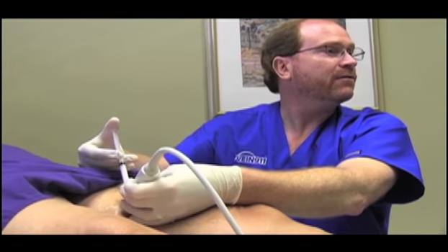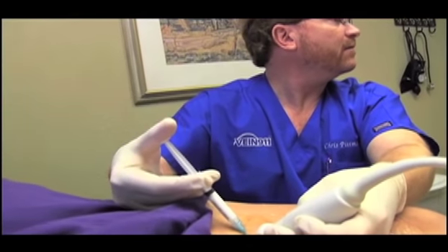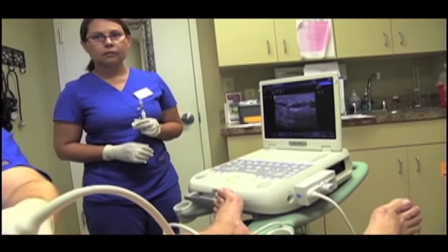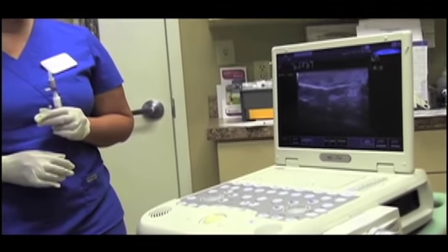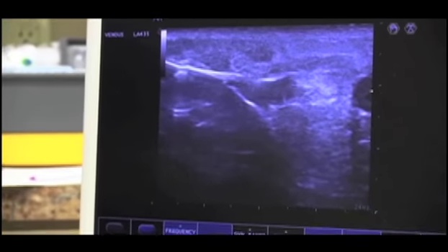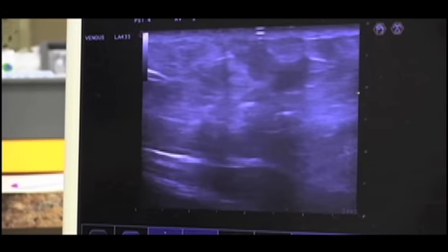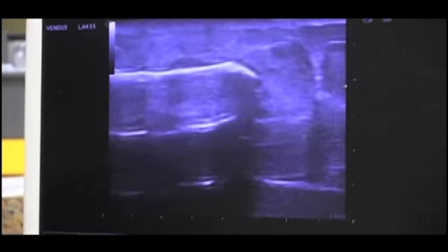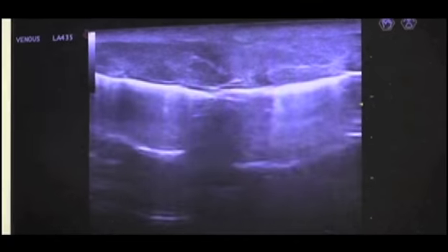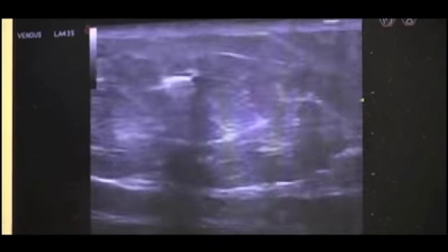This is a tiny 25 gauge needle — you feel just a little pinch. I can see exactly where this needle is going, and I am right in the center of that vein. You can see the needle in the vein and now I'm injecting the foam. You can see the vein literally disappear immediately — it spasms. That white snow you see is actually the foam, and by virtue of the bubbles it's very echogenic, or white, on the ultrasound.